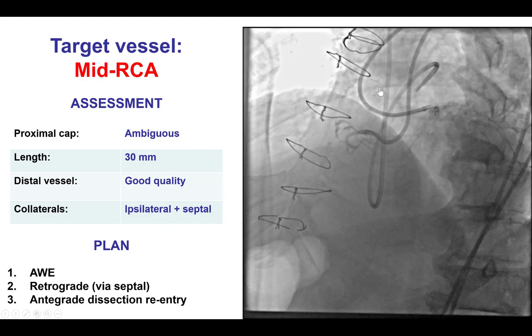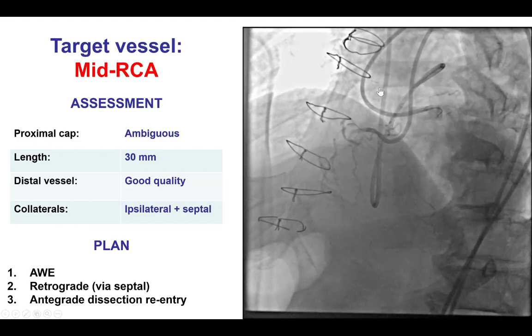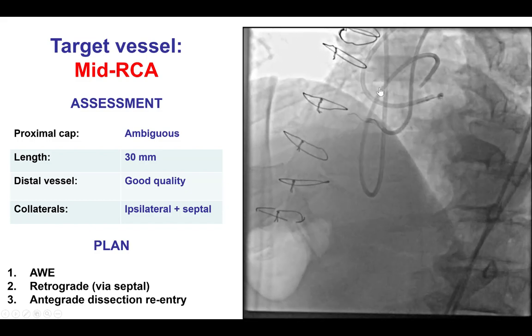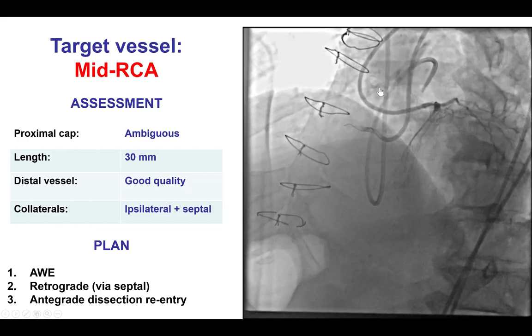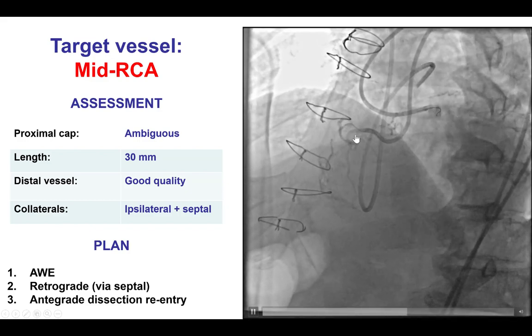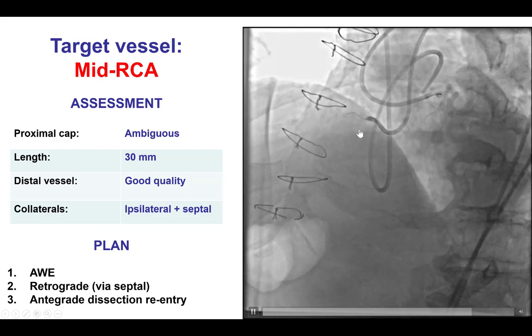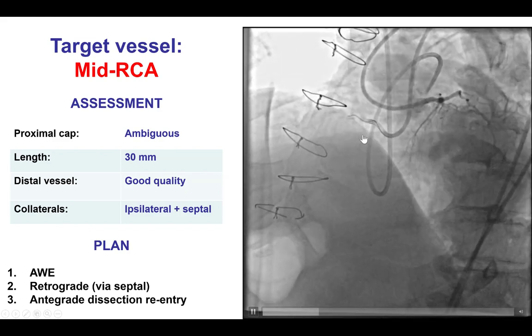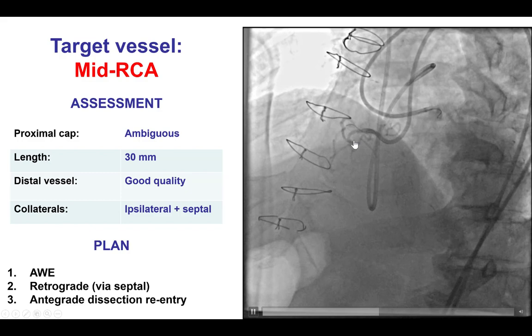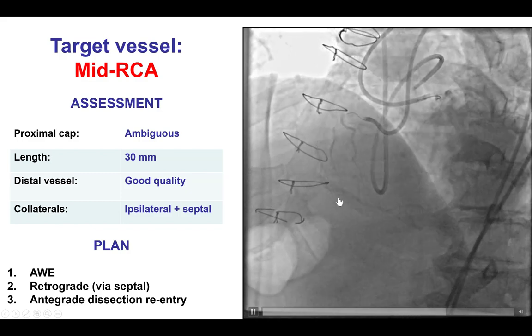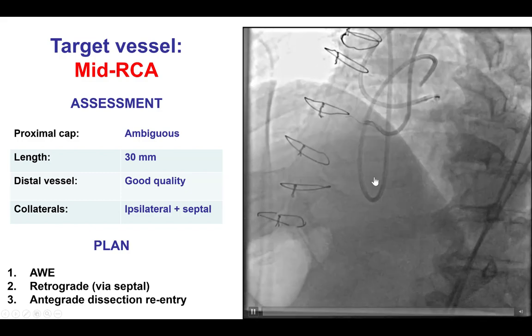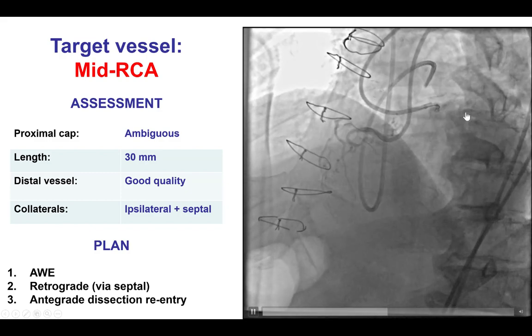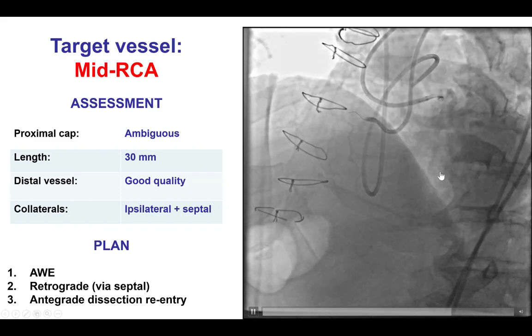In this patient, given the ischemia in the inferior wall on stress testing, we decided to perform PCI of the right coronary artery CTO. The proximal cap was ambiguous with several branches originating in the proximal course of the vessel. The length was approximately 30 mm. The distal vessel was of good quality and was filling both by ipsilateral epicardial collaterals but also there was some filling from septal collaterals.